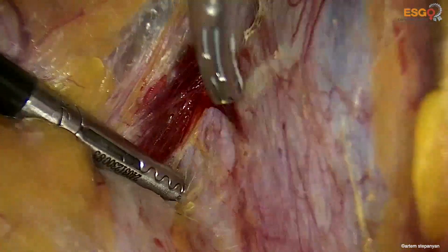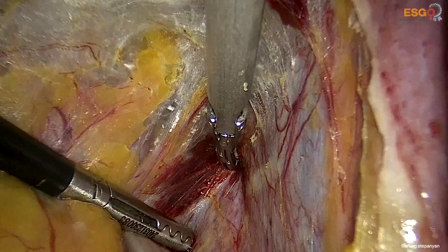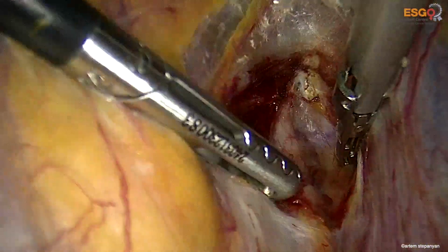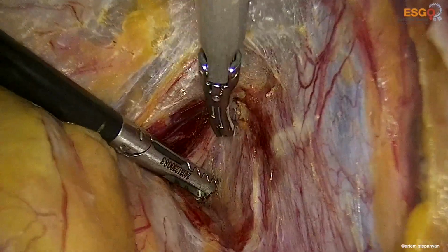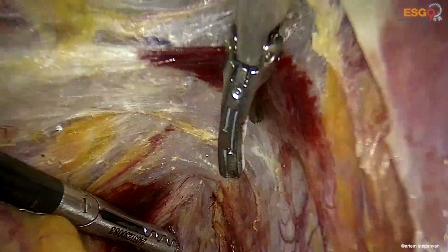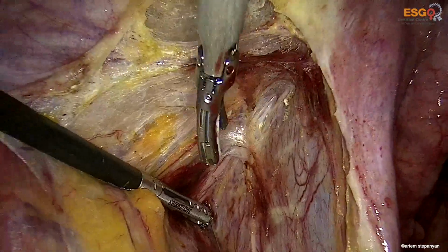Once the ureter is identified, our task is to detach the ureter from the underlying peritoneum. In this case, it is the posterior leaf of the broad ligament of the uterus.